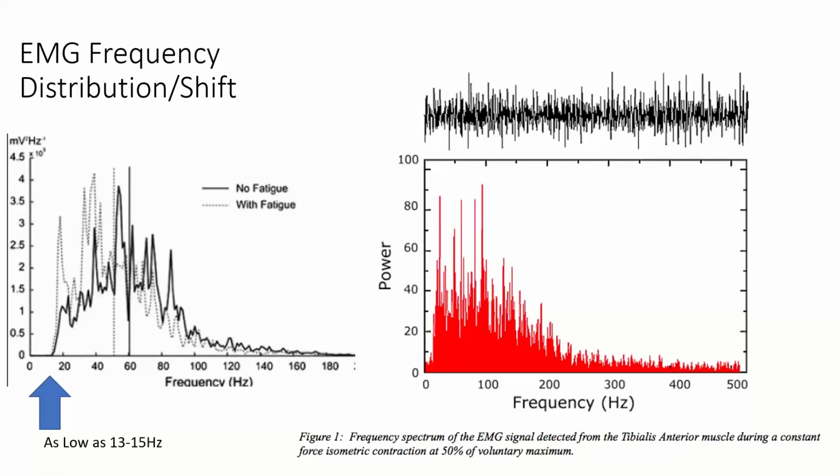Now here's the EMG frequency distribution and shift, as I've shown you. Here's 0 to 500. And at the top you can see the complex waveform that EMG creates, and you see this on your screen. Tom at Brainmaster used to call it the fuzzy caterpillar. He said, if you've got a fuzzy caterpillar, you've got a bad connection. You should get a nice clean line, but this is what you get with EMG, and we'll look at real trend screen samples of it as we go on.